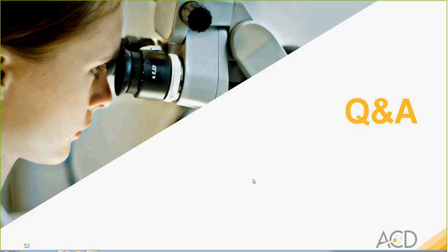Melanin is a pigment that's typically brown in color. That's very similar to the brown chromogenic clusters that are seen in higher expressing RNAscope targets. I would recommend, in the case of melanoma research, to look into using an alternative chromogen.